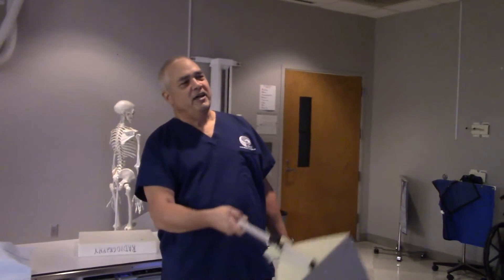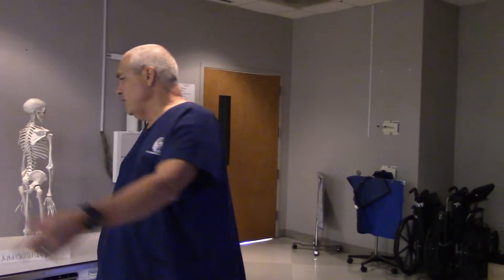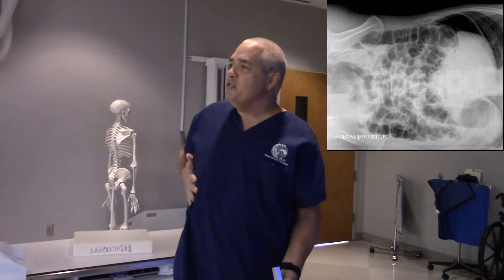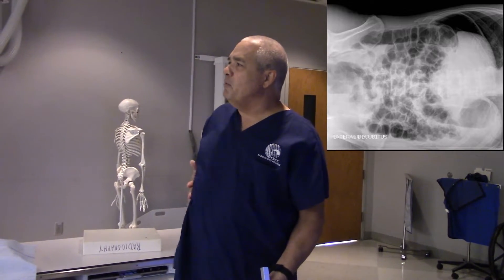What are we looking for? Y'all sat in a big old lecture for like three solid hours. It has to do with the stomach. So you want to have the liver up to provide the contrast to the air. We want the liver side up so that just in case there's any free air bubbling around in there, we'll see it.